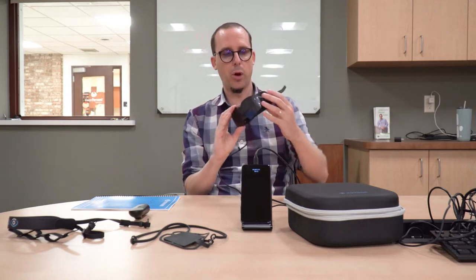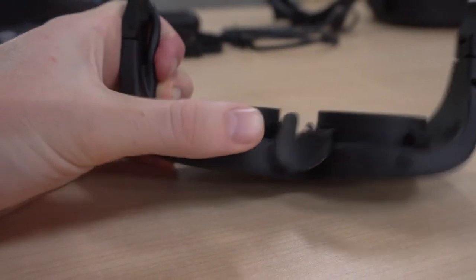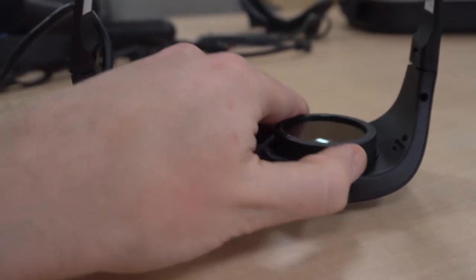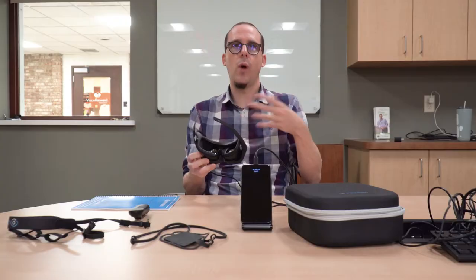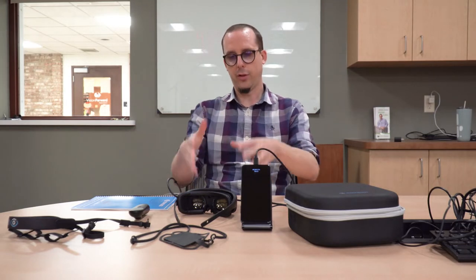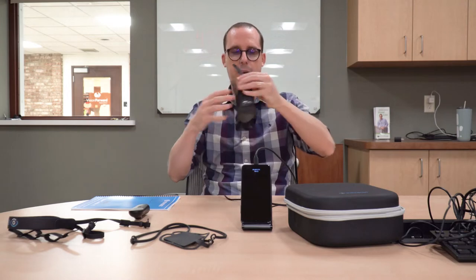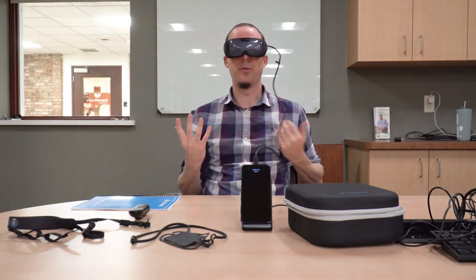A few more things about the design that I like. This device is not designed to be worn over your glasses. To enable that, they have these dials underneath that you can adjust to change the dioptric power in here. If you wear glasses, you can correct for your prescription using the dials built into the headset - you have about eight dioptres of adjustment. That means you can take off your glasses and just wear these. If you have high levels of astigmatism like myself, you cannot adjust for that with these glasses, so in that case you might want to wear these over your own glasses. I can put this on over my glasses absolutely fine.